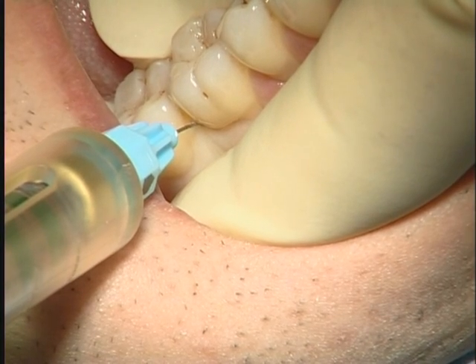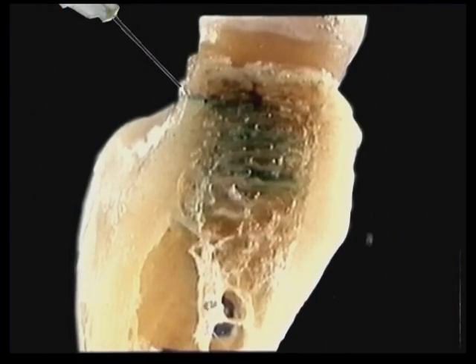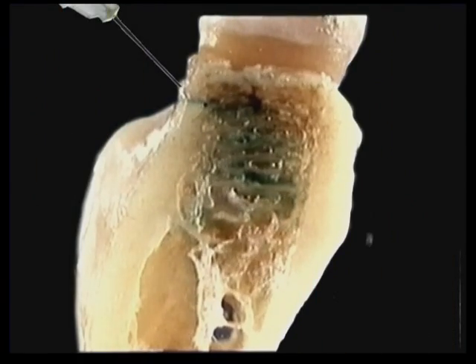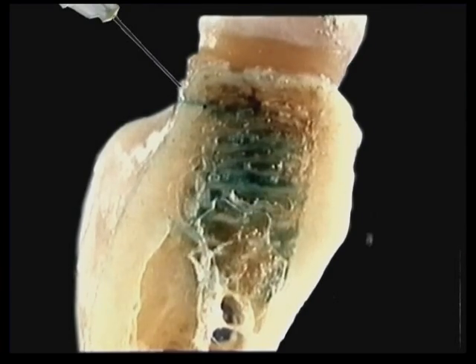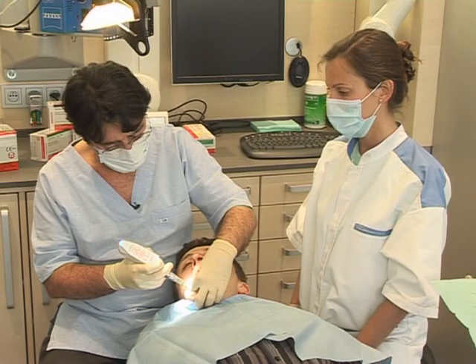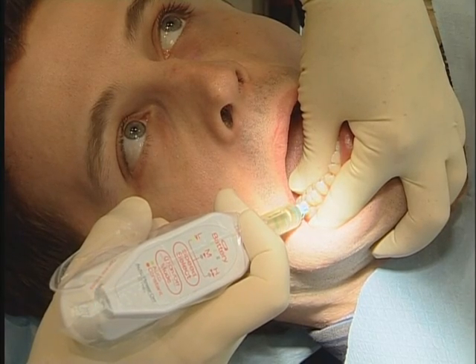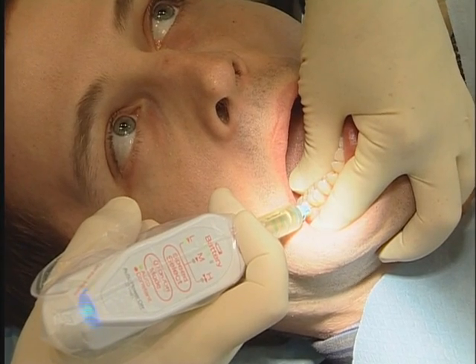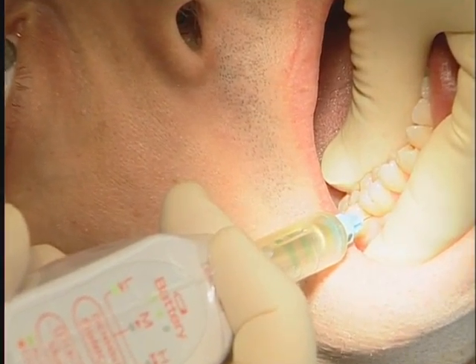After injection of 2 to 4 tenths of a milliliter of the solution, anesthesia of the alveoli and pulp is rapidly obtained by diffusion of the anesthetic through the bone. However, in common with any intraosseous technique, the duration of action is limited as the spongy bone is well vascularized.